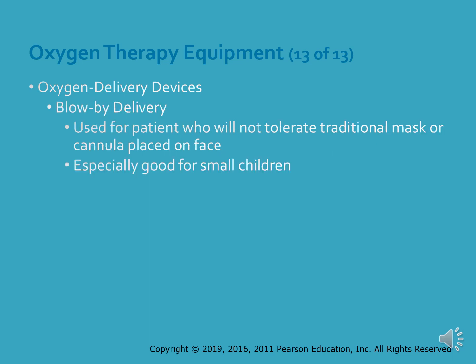A blow-by device is another technique for the delivery of supplemental oxygen to a breathing patient. It is called the blow-by method. It can be used for any patient who will not tolerate having the traditional mask or nasal cannula placed on his or her face. With the blow-by technique, you can use the non-rebreather mask set to 15 liters per minute and simply have the patient hold the mask as close to the face as they are comfortable. This technique is especially good for small children who are typically frightened by the mask or the cannula. Be sure that the mask is held as close to the face as possible to ensure a good supply of oxygen reaches them.